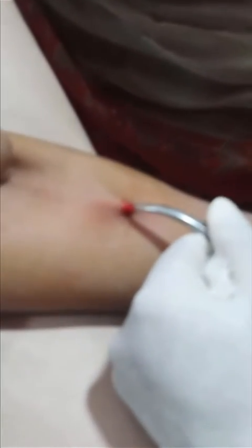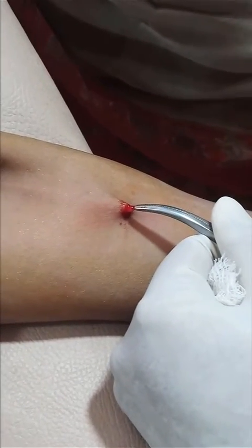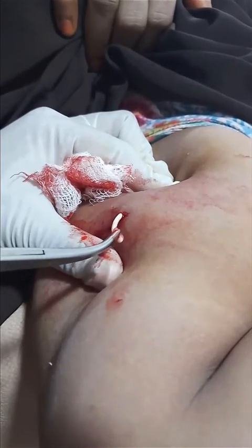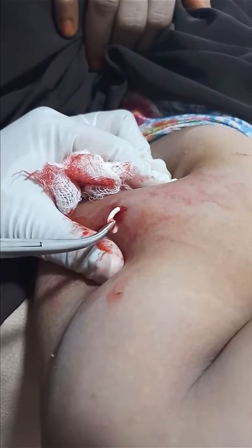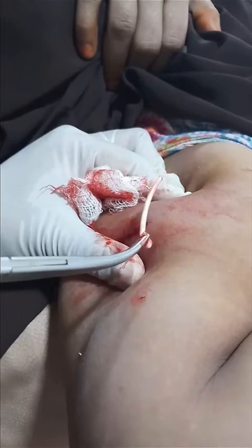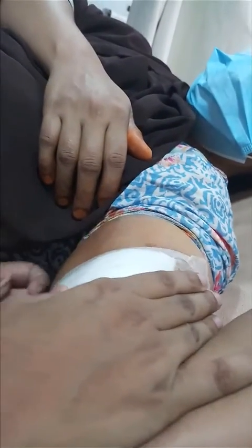Then the implant is removed with the artery forcep or implant hook. In this video the implant is removed with the artery forcep. It is a rod-like structure. After removal, a dressing is applied over that part and the patient will remove it after one day.